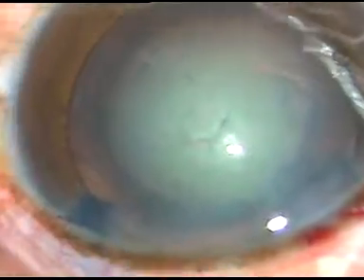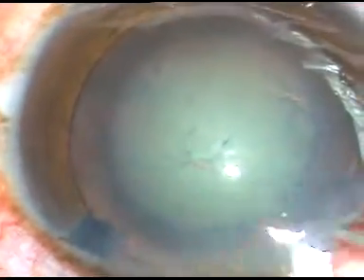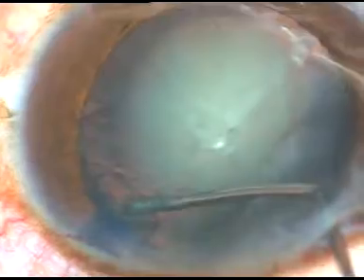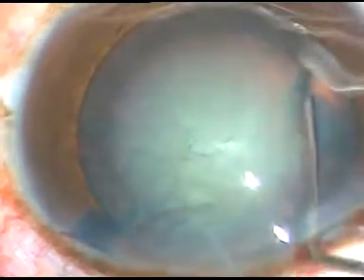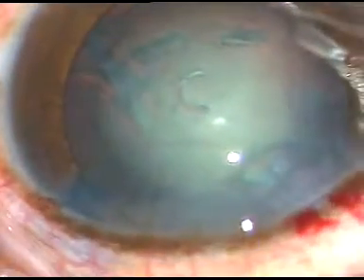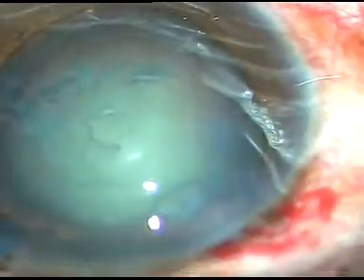Now hydrodissection is done. Fluid is passed underneath the anterior capsular rim. Hydrodelineation is attempted but it did not happen — the nucleus is rotating, so I am not bothered about hydrodelineation.